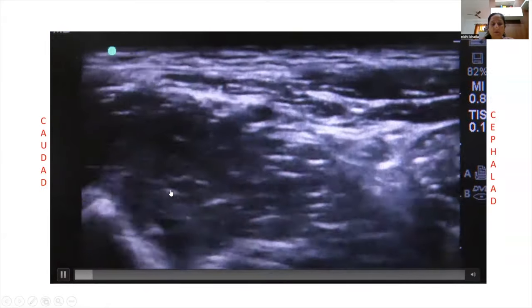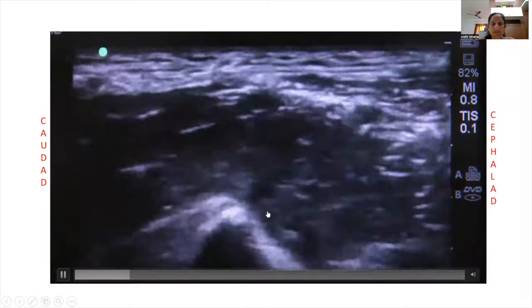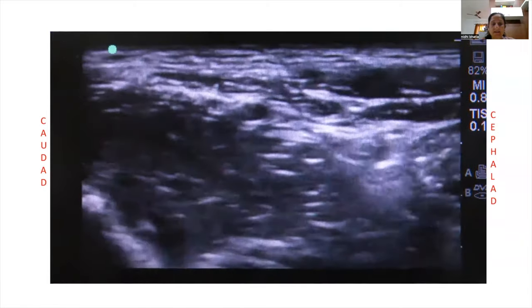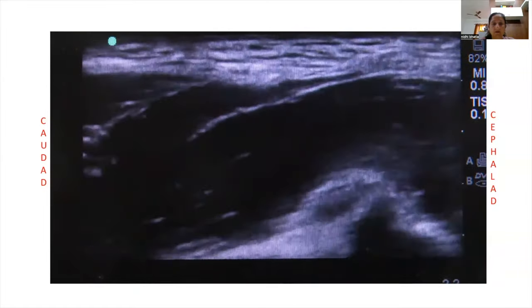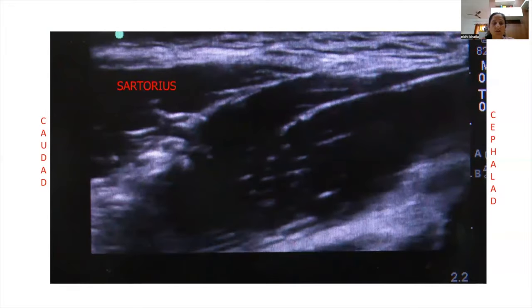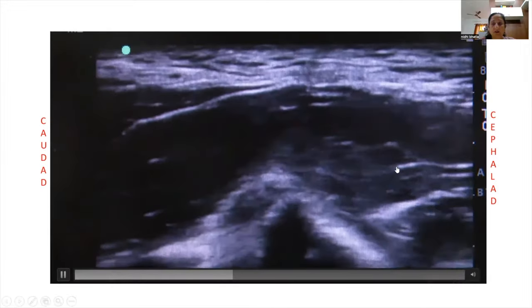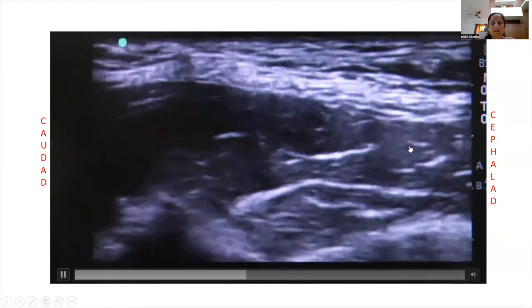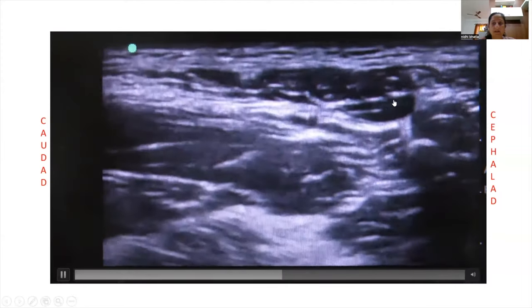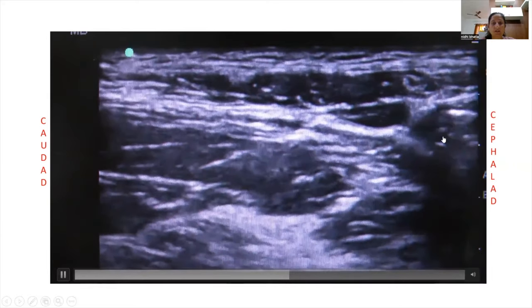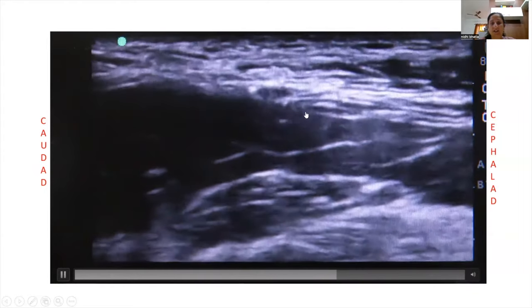In this video, the probe is positioned for the suprainguinal approach. You can identify the anterior inferior iliac spine, the iliacus muscle just above it. Moving caudally reveals the sartorius muscle; moving toward the head end shows the internal oblique muscle. The pulsatile deep circumflex iliac artery is visible just above the fascia iliaca compartment, and gut movement of the peritoneum can also be seen.